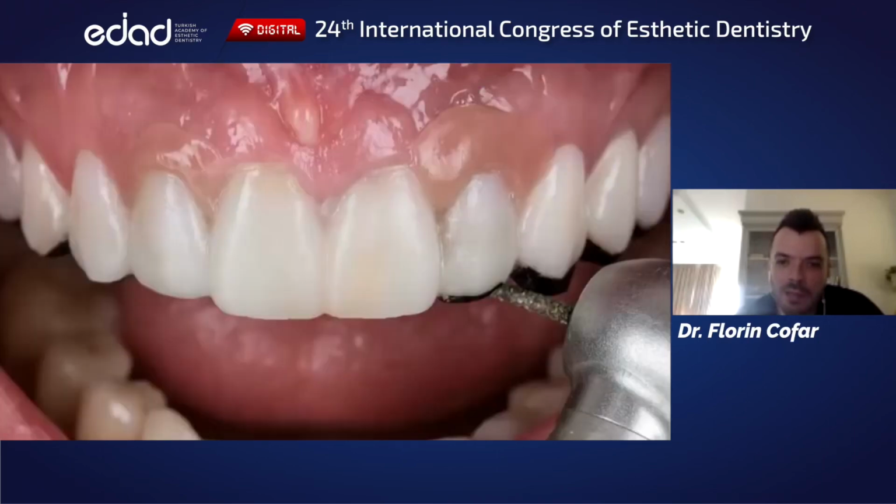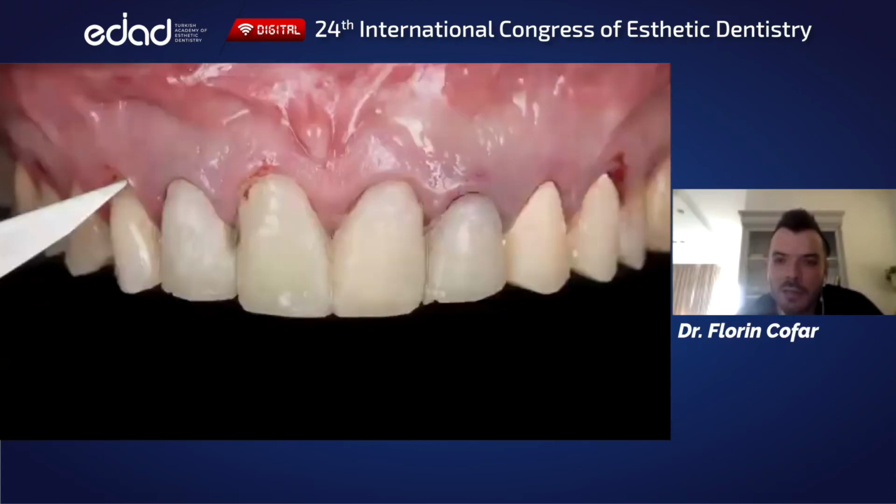And then the second that we are convinced that this is what we want to do, then I go in and adjust, and I would first cut the black areas and then immediately after do the tissue according to the design. Now, one thing I always do after this tissue recontouring and also with the prep.